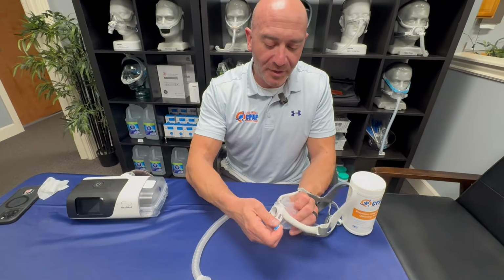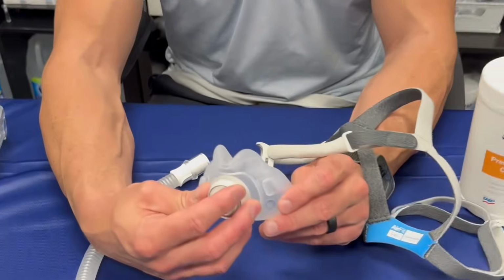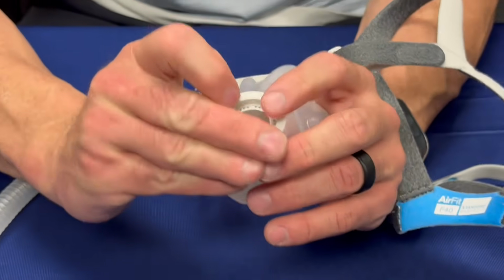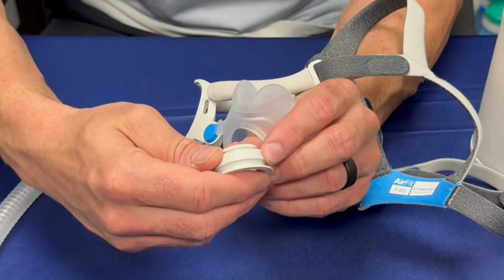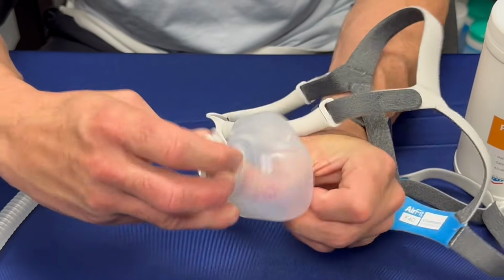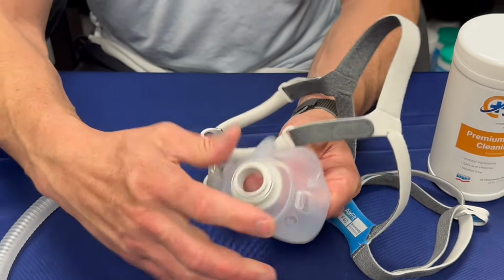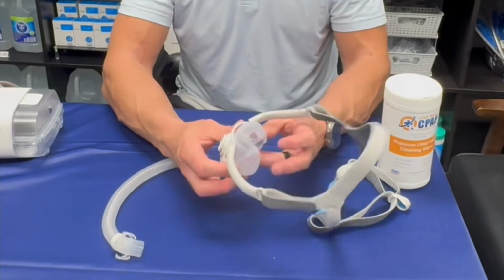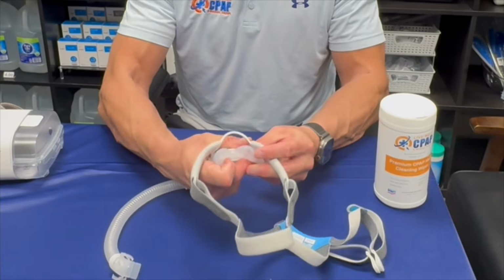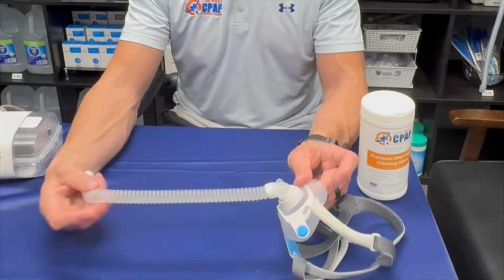Now, there is one other small piece that's not really designed to come out. It's part of the cushion, and when you get a new cushion, it is in there, but this piece may occasionally come out. You'll notice that's where the exhalation ports are, and there's a diffuser on there. So if it ever does come out, just stretch the cushion over it. Get it around that circle there. And then, of course, putting it back into the frame as I had kind of shown before. So very simple, very easy to use.